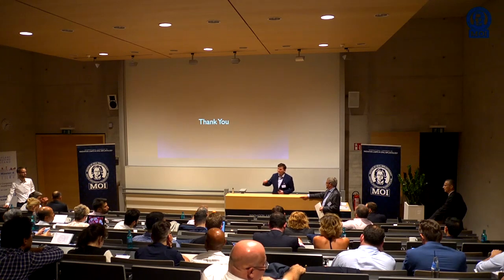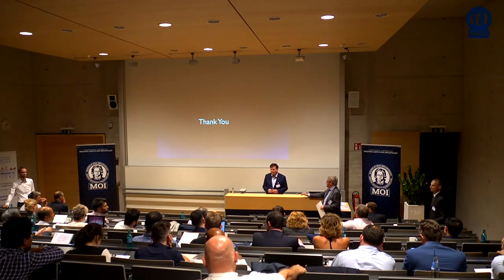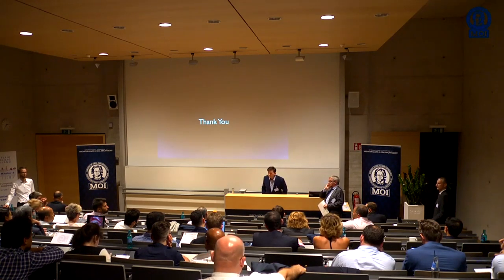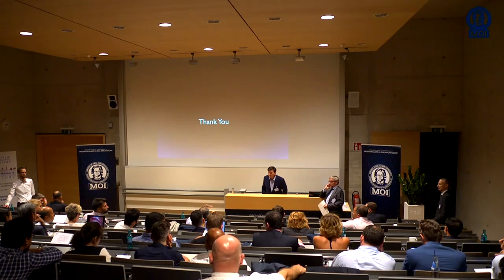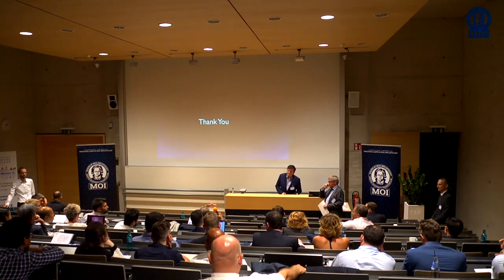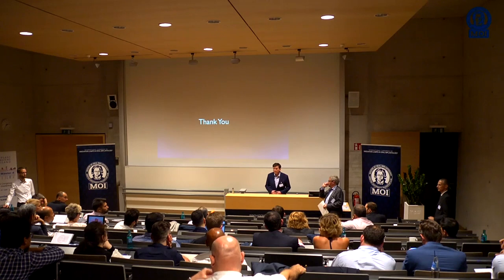Well, in Implant Studio, I can see the reference of where the teeth are, the gingival margin. This is on the positioning. You're planning to cut a little bit of bone, yes, right? Where do you plan to place your implant? Here or here or here? Before, when you're planning. Exactly, yeah.